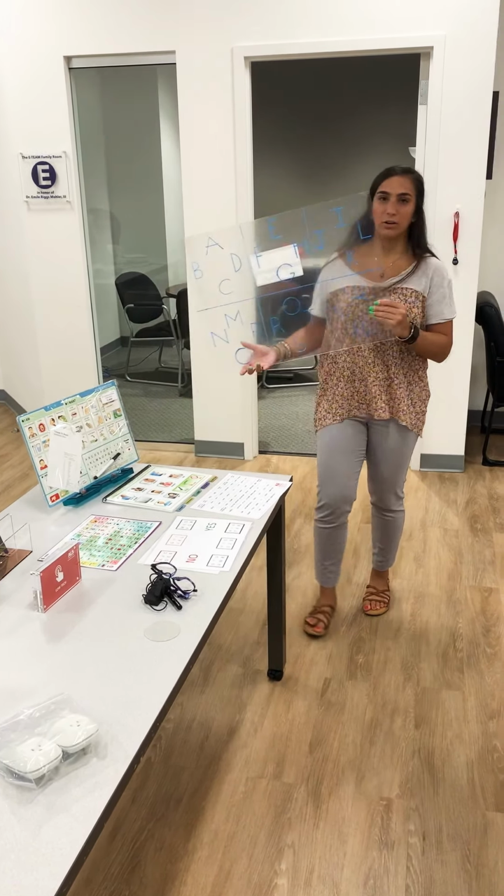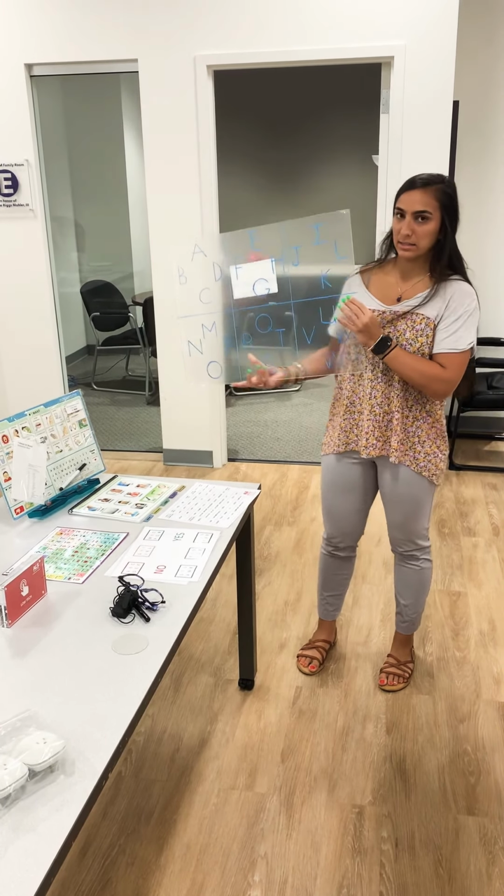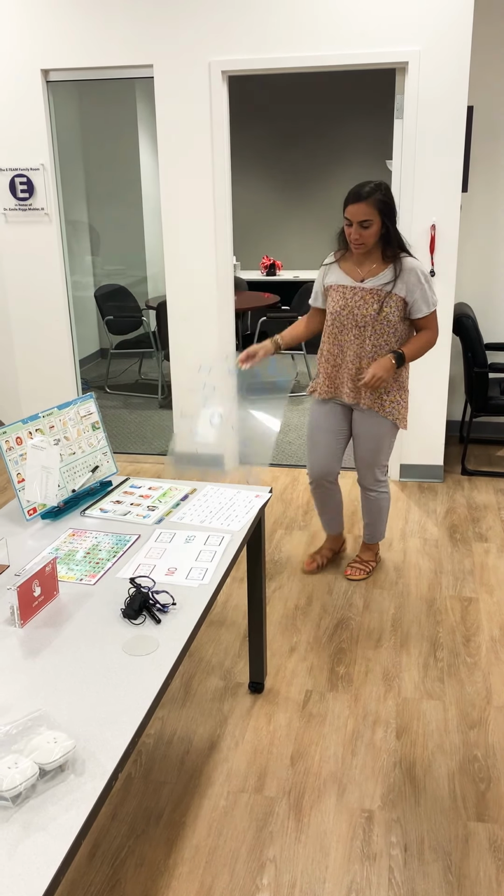You can also create your own if you need something that's larger. For a patient who might be in bed and needs something hanging up on the wall, this is always a good option because it's large and easy to see.